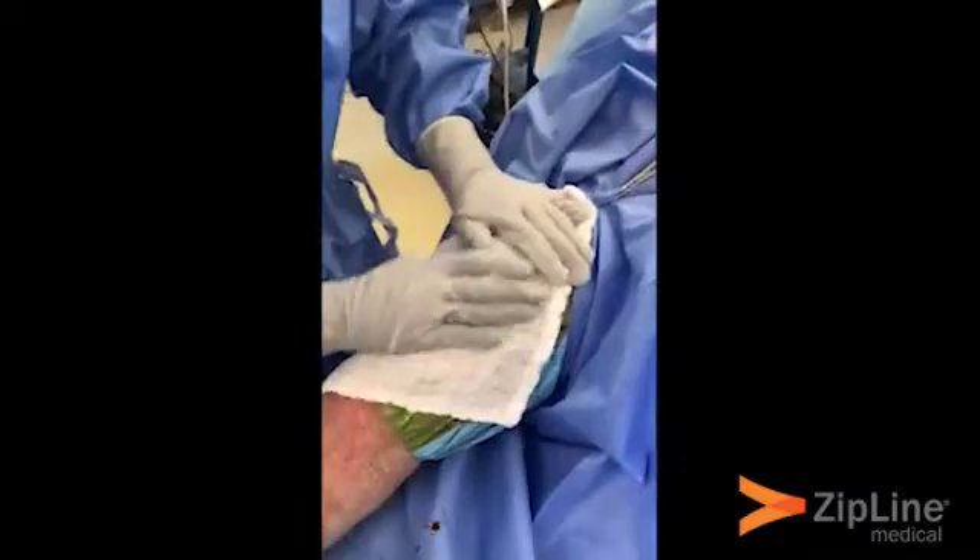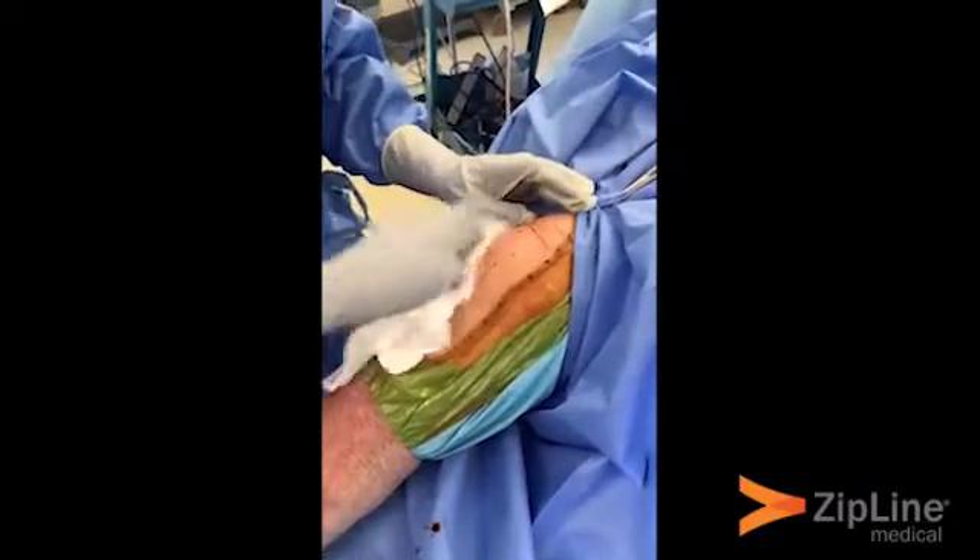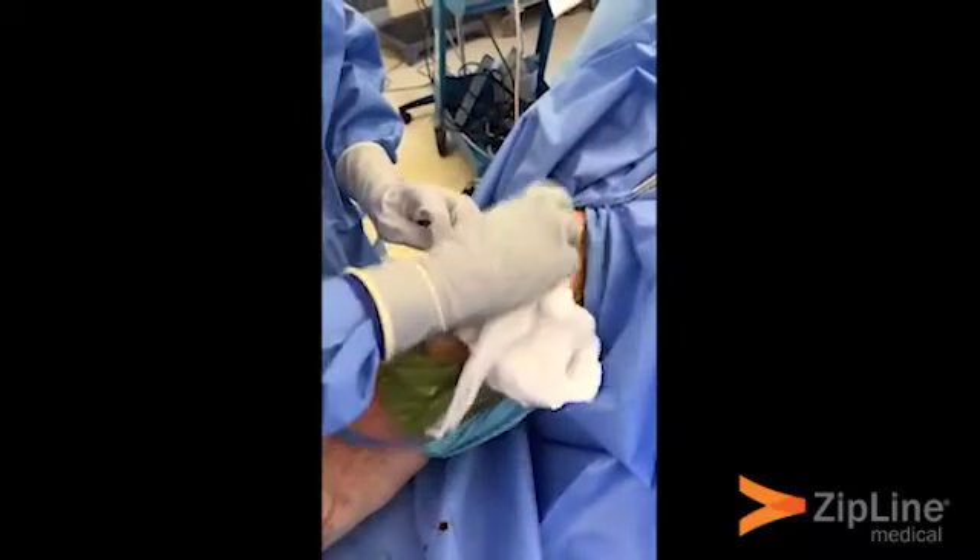The subcutaneous layer is closed. Make sure the incision area and the area surrounding the incision is perfectly dry so that the Zipline can adhere.